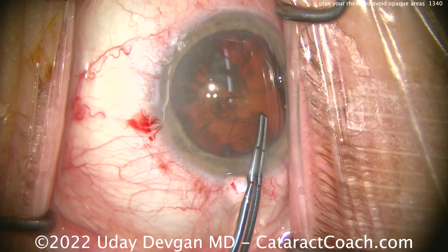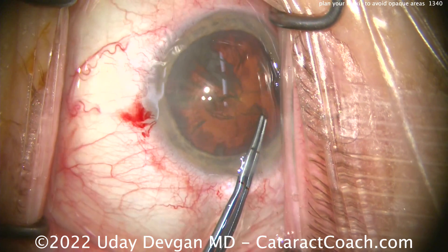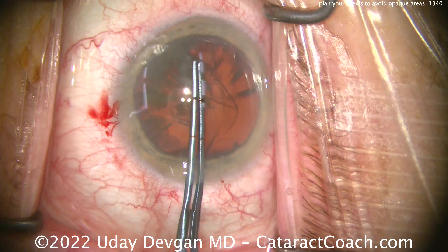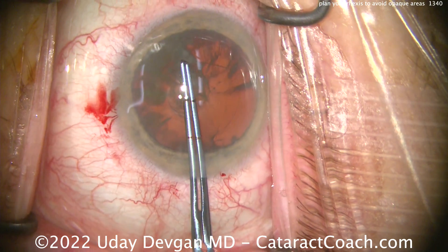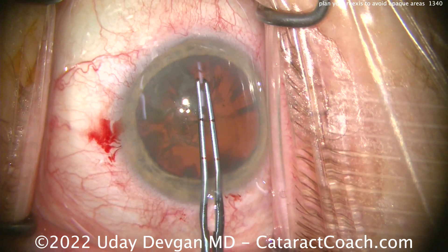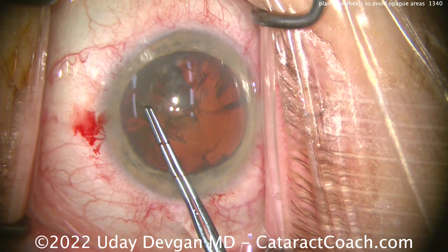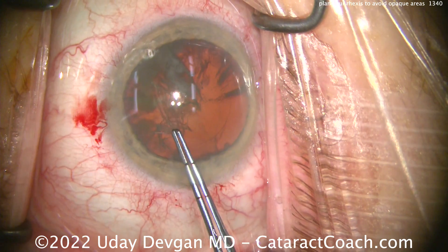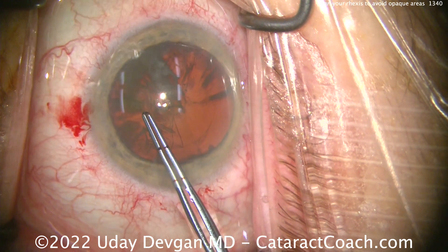Your view is 9 o'clock, patient's 12. Measuring out that rhexis again, and now in this quadrant I have a really good view, so I'll keep continuing it. I'm letting go and regrabbing only in a spot where I can still have a good red reflex, like right here. And now in this part you just go right through that area — you lose the visualization for a moment, but you can certainly just complete it. There it is. Easy enough to finish up this case.